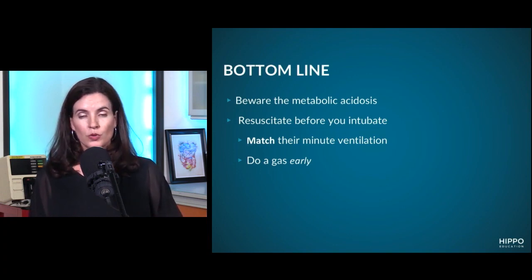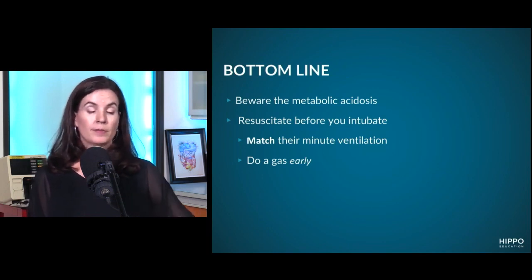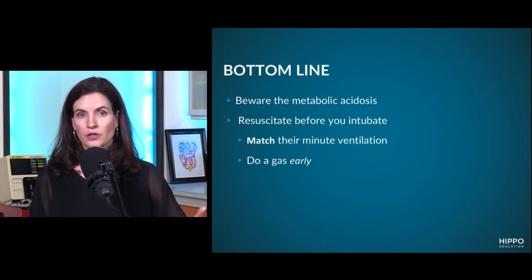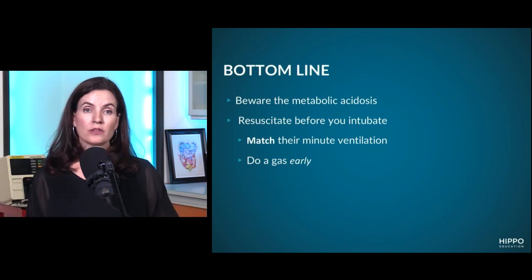But then when you do have to intubate and you're setting the ventilator, match their minute ventilation. That means match their respiratory rate and match their tidal volume, if not exceeding it by a little bit. And do a gas early to make sure you're on the right track.